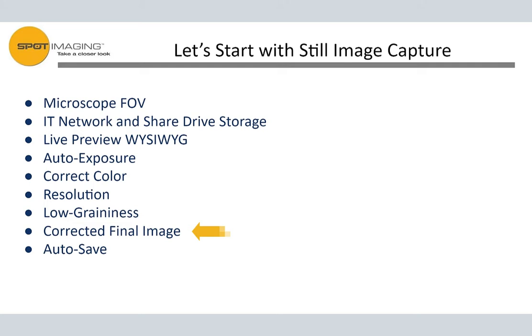It's just a factor of how the sensors are gathering their light. There's something called micro lenses on the chips, and in the corners, the light hitting those corner pixels is coming in at an angle, so there's a drop off in sensitivity due to that. The illumination itself, even though your eye doesn't detect it, there's a little bit of fall off towards the corners.